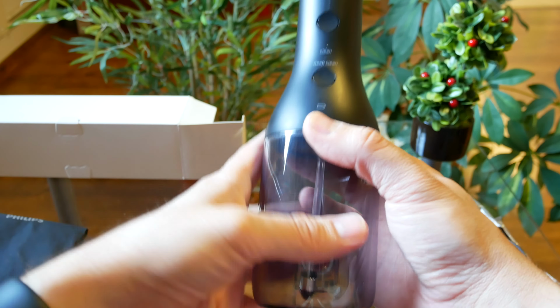It has a quite large reservoir. I think it's 300 milliliters, and can be opened and filled with fluid via this, or I think you can twist and open it.